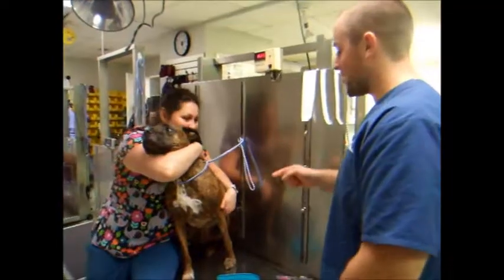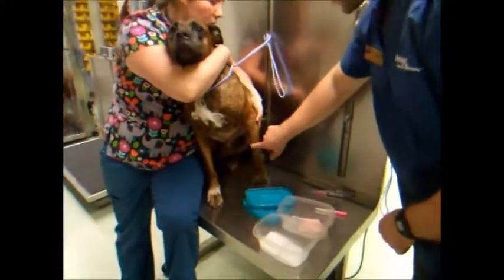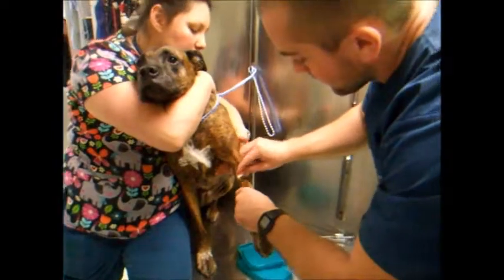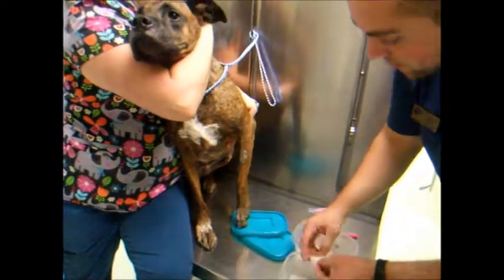This is my preceptor, Bernard Bleem. He's the managing DVM here, and he will be following me as I do some of these tasks. I'm going to go ahead and place an IV catheter on a dog here, in the cephalic vein. I already shaved, just got to prep it now. So let's get 3 rounds on here, the chlorhexidine and the alcohol prep.